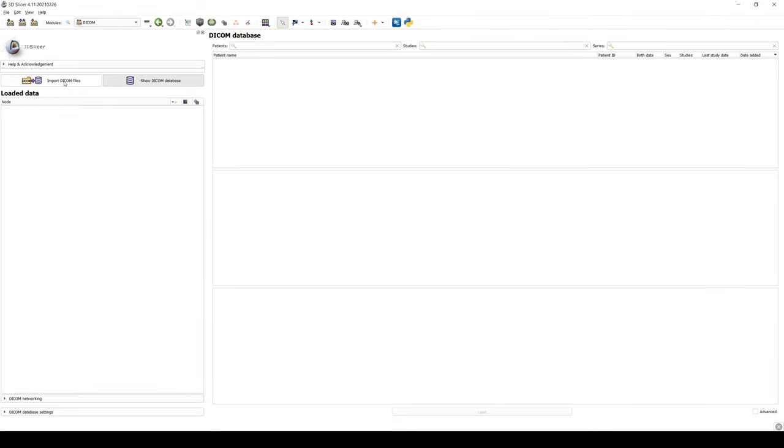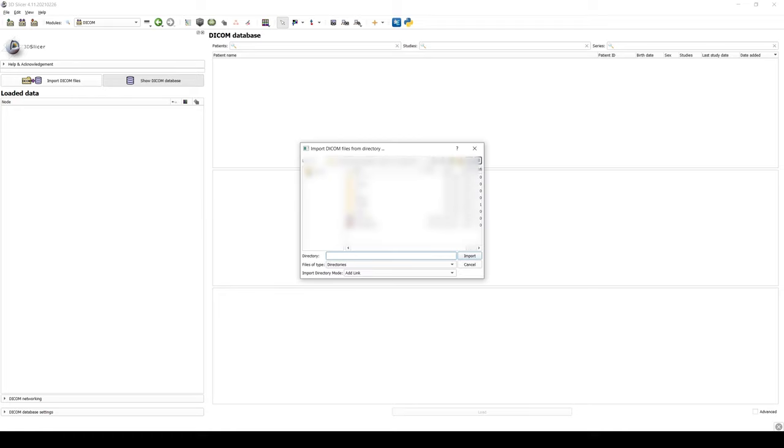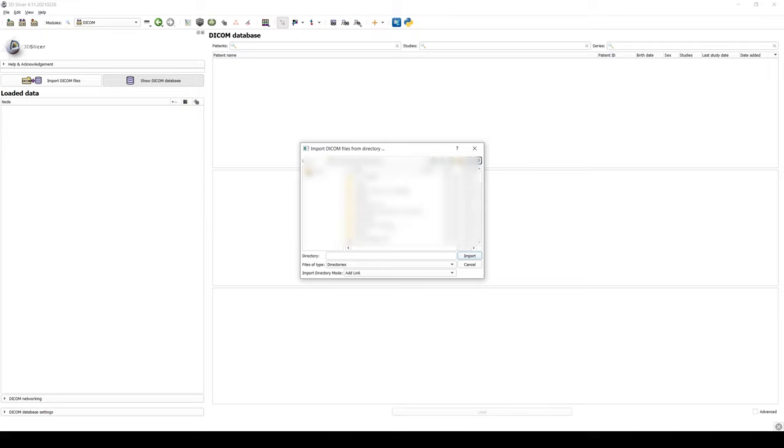The first step is to import the DICOM images. DICOM documents are the raw data acquired from a radiology department, for example, on either a USB key or a CD. Here I transferred the files onto my computer for this demonstration.